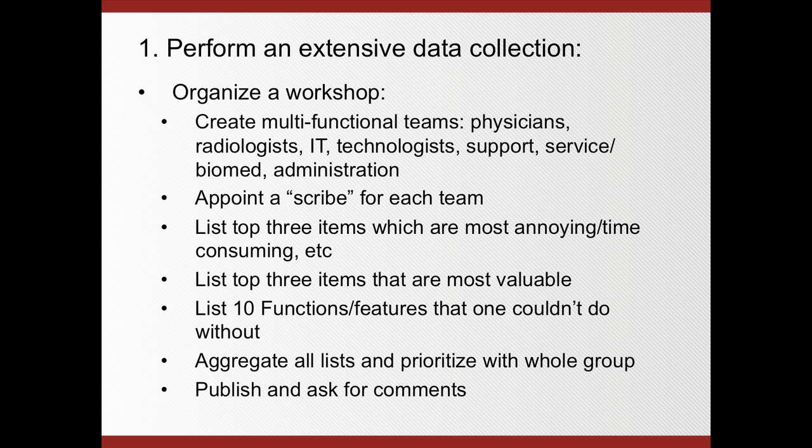I've seen actually systems that the radiologists were relatively happy, but the people that were supporting the IT background were very unhappy because they were aware of some major potential issues. Or the other way around, that the support people thought this is a great system, but that physicians were unhappy. So we want to make sure that we get everybody involved, so we can look at all the aspects of the system, not only how it is performing, does it meet all the requirements, not only from a user perspective, but also from safety, patient privacy, support, and of course, does it meet the requirements for the administration? Is it costly, is it not costly, and things like that.